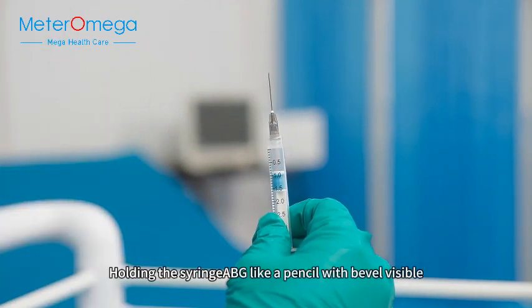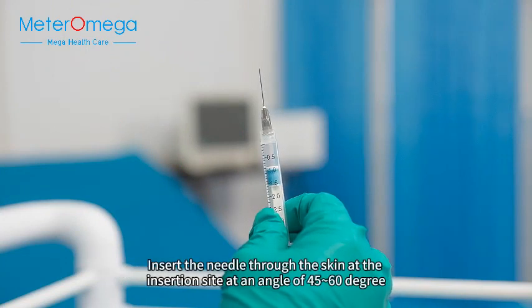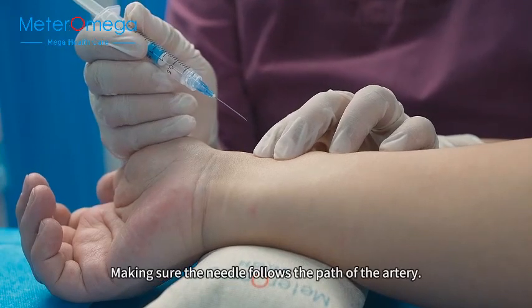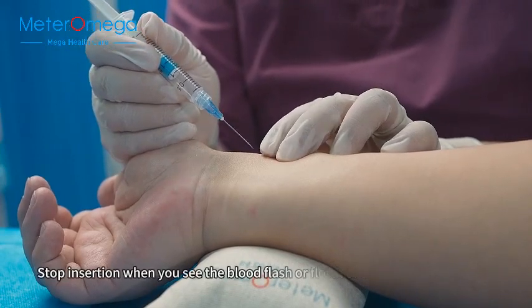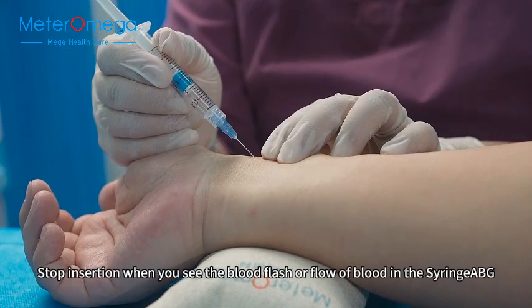Holding the syringe up like a pencil with bevel visible, insert the needle through the skin at the insertion site at an angle of 45-60 degrees, making sure the needle follows the path of the artery. Stop insertion when you see the blood flash or flow of blood in the syringe barrel.